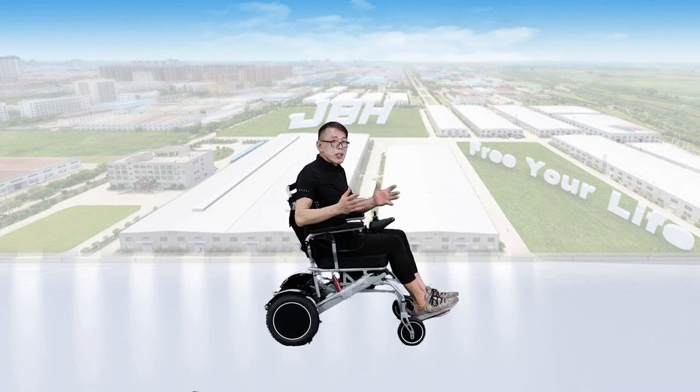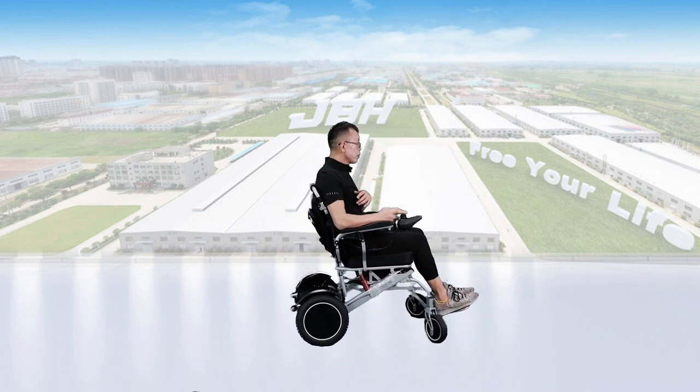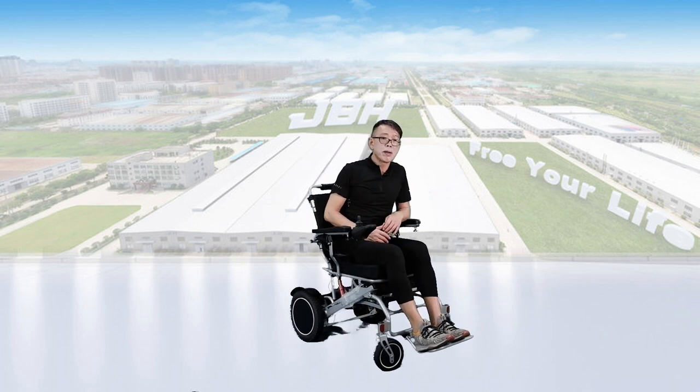The battery has already been charged. Simply turn the power on and you can start to drive the wheelchair forward, backward, or to both sides — right and left. Even a 360-degree rotation is no problem.